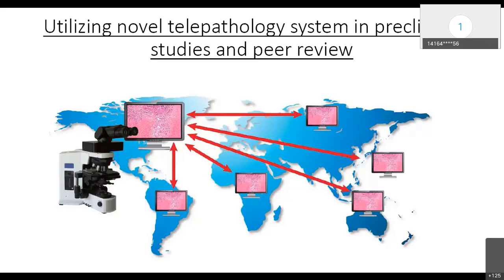And there are also a number of microscopes available where you do not need a scanner. Just connect your microscope to the internet and it will be like I am seeing in the microscope and you would be seeing on your screen. If I move the slide, you would see that the slide is being moved. So real-time slide observation can also be done when such microscopes are used. That can help you conduct the peer review in a much faster way, especially when you have peer review pathologists from outside your country. And this has now become very frequent and regularly used.